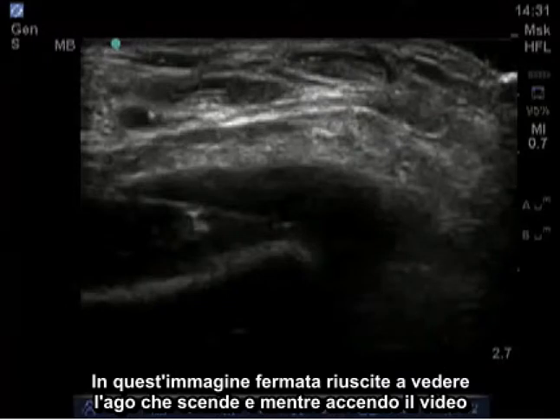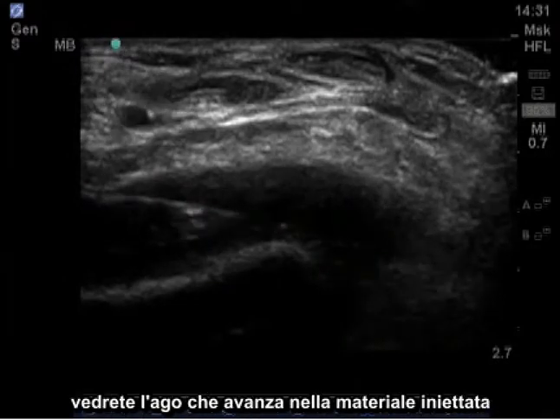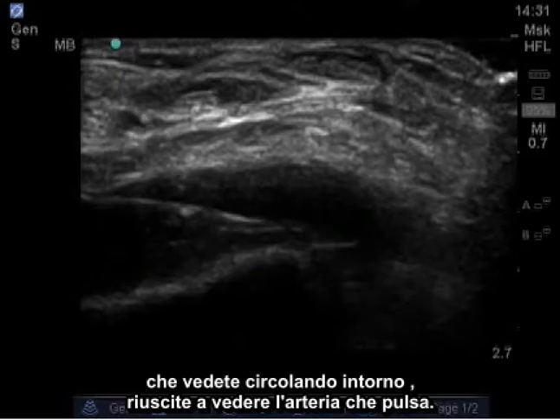In this still image, you can see the needle coming down. As I turn on the video, you'll see the needle advance in, inject material, which you can see circulating around. You can see the artery pulsating.